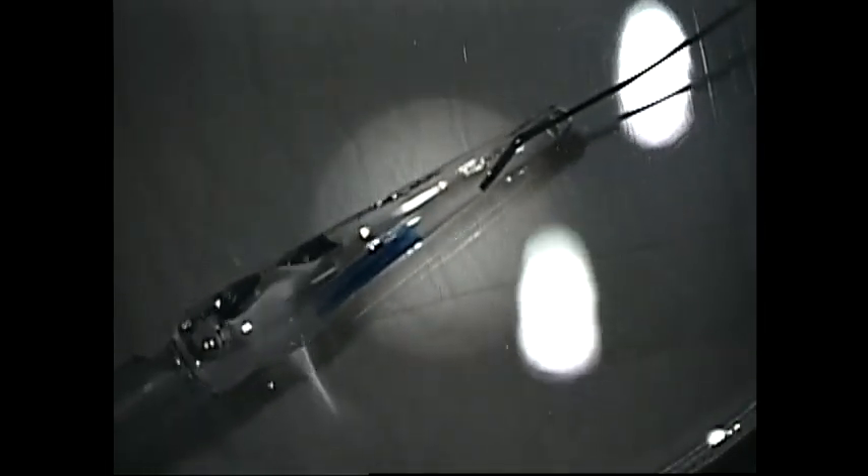In this clip I show how to deal with a graft that is adherent to the wall of the Stryko Jones tube injector. If gentle aspiration and irrigation of the fluid is unsuccessful in dislodging the graft, I use a 27-gauge cannula on a 3cc syringe of balanced salt solution and inject through the ostium of the tube to gently dislodge the graft. I cannot emphasize enough that these are very gentle motions so that you do not irrigate the graft completely out of the injector. There you can see the graft is now freely mobile inside the Stryko modified Jones tube.